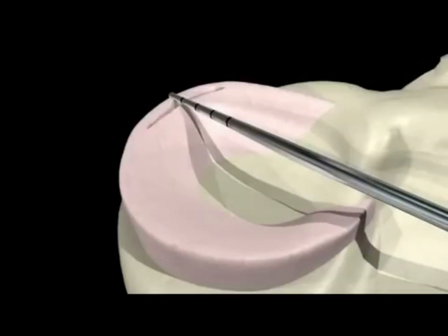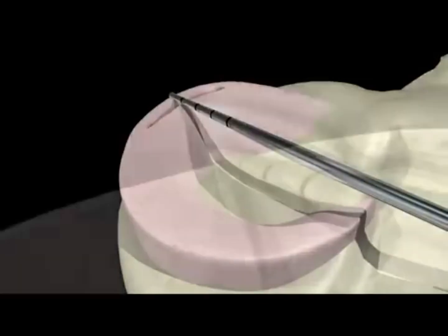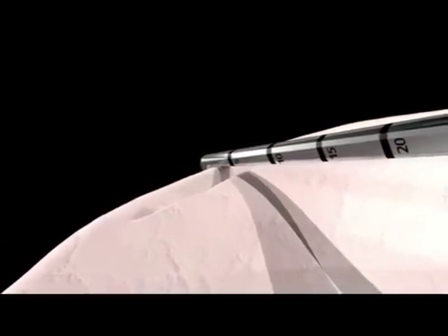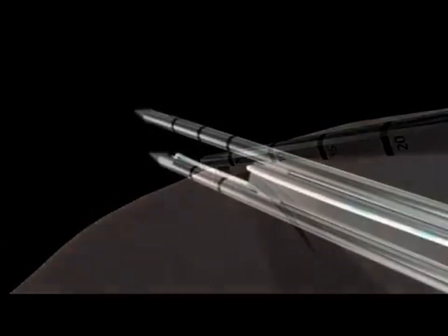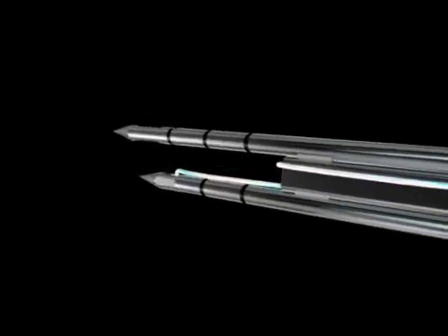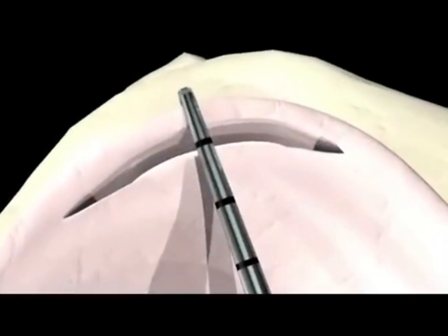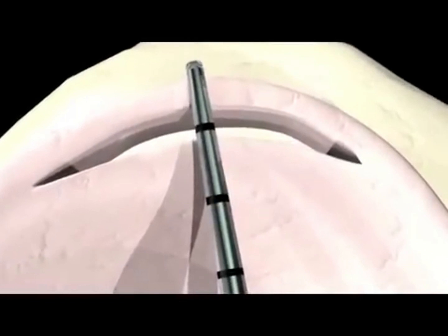The probe is advanced to the back of the meniscus and visually assessed. Depth laser markings on the probe are indicated at 5 mm increments, as are the depth markings found on the needles of the AS meniscal repair device. Record the intended depth of penetration at the repair site. This will serve as an indicator as to how far to advance the AS meniscal repair device and help gauge proper penetration of the tissue.